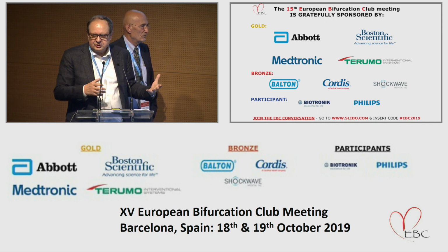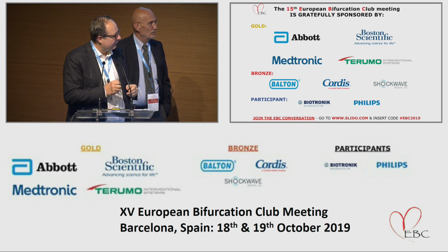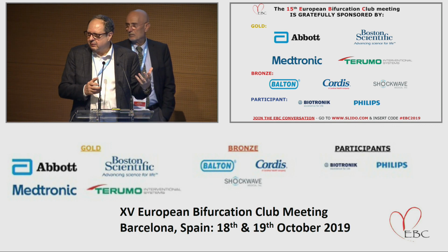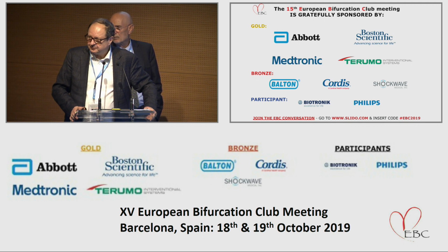The nano crush that was described earlier, I have a bit of an issue with, because I'm not sure you can tell angiographically whether you actually covered the entire ostium. So that's my concern about the nano crush. You don't need to cover all the circumference of the ostium. Why don't you? Why don't you?